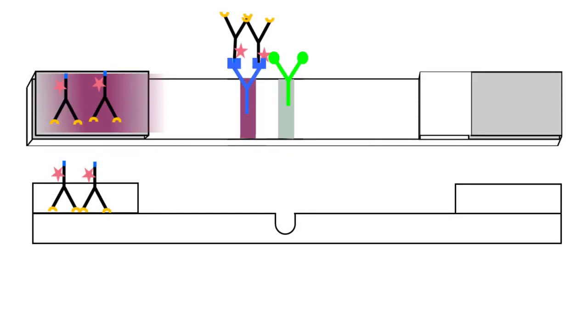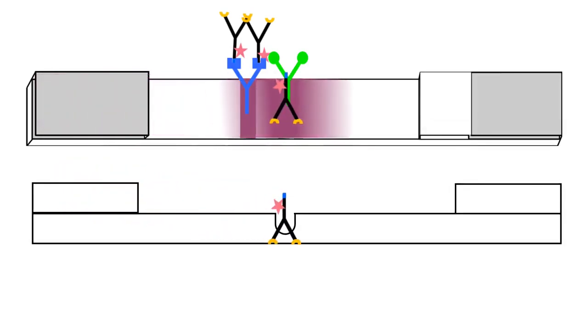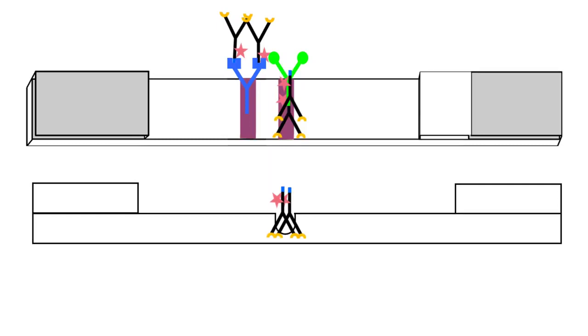Now, the problem with this is that if we look at the strip from the side, as you see here, there is a den where the test line has been coated. If we have reverse migration because the strip has dried out, the conjugate that did not bind to any antibody on the control line might get stuck in this little den and hence cause a false positive readout. This backflow effect will lead to false positive results if the test is not read within the recommended time of reading.